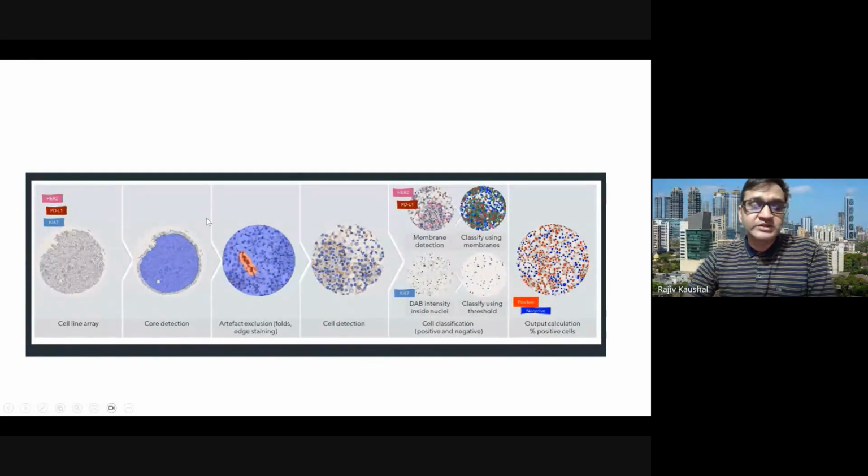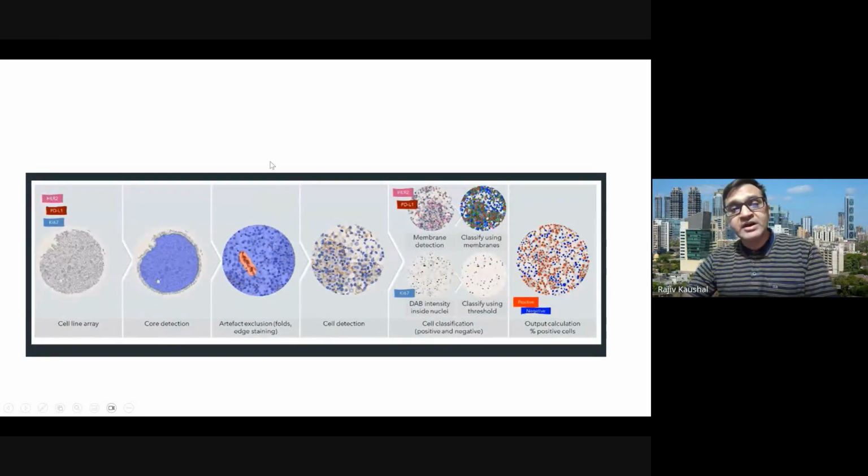First, the tissue, the representative tumor tissue, is identified. The background quality check is very important when you are using these for IHC interpretation, so a check for any digital artifacts. There are some algorithms incorporated while developing these models, so that any confounding factor resulting from these artifacts can be eliminated.